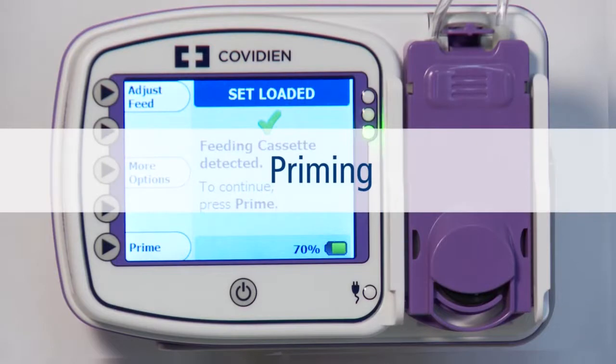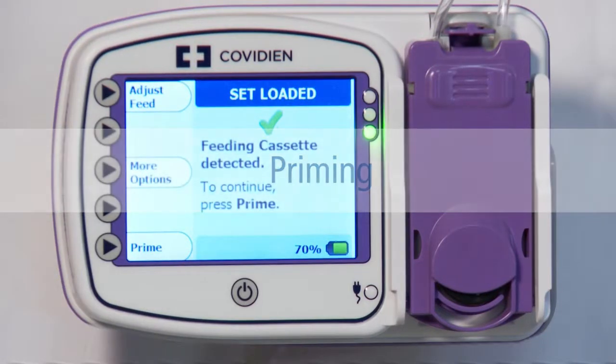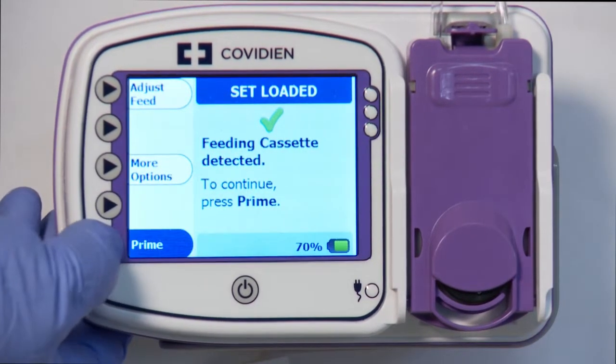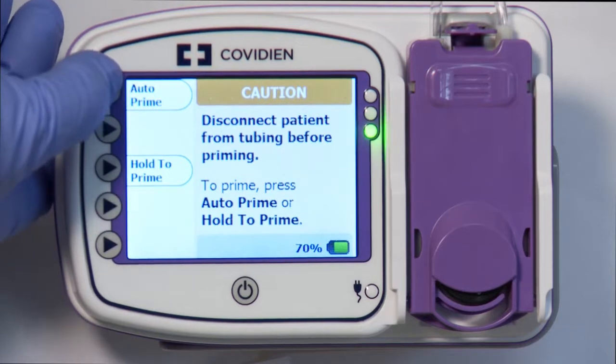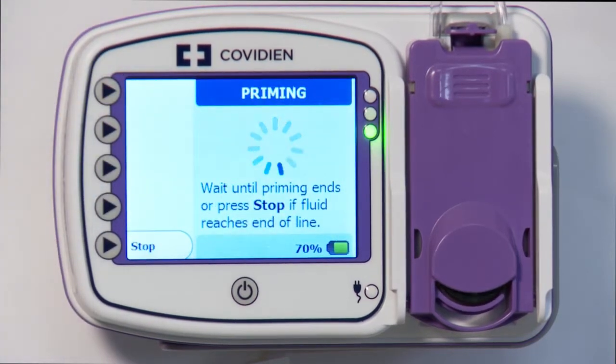You are now ready to prime the feeding set. Press the Prime button to continue. Note the warning on the screen. Select Auto Prime to automatically prime the feeding set. The pump will show an animated timing sequence indicating the prime is in process. Wait for the priming to complete.